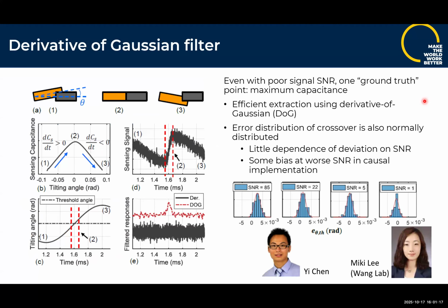Speaking on the poor signal to noise point of view, we have our capacitance versus angle models. They're not particularly perfect. As the finger moves through, you get a certain sensing signal with the real thing somewhere in this big noisy signal, and then it transitions again. You don't have a perfect model of that capacitance, but you can do an okay estimate of angle versus time.